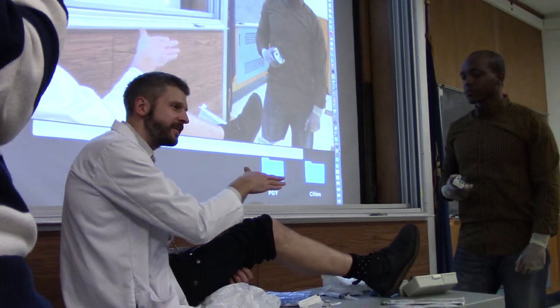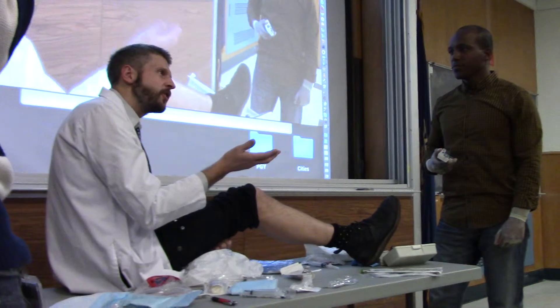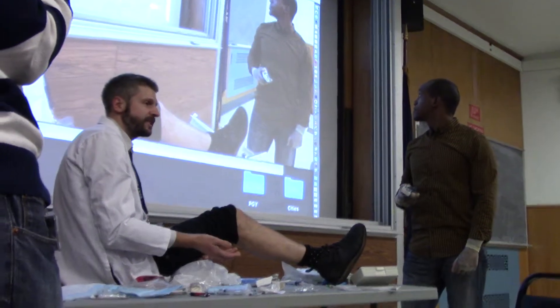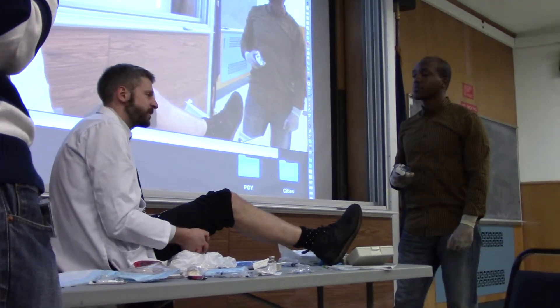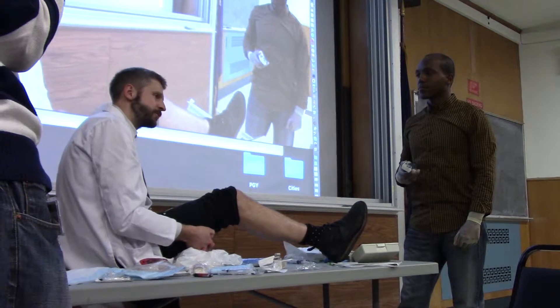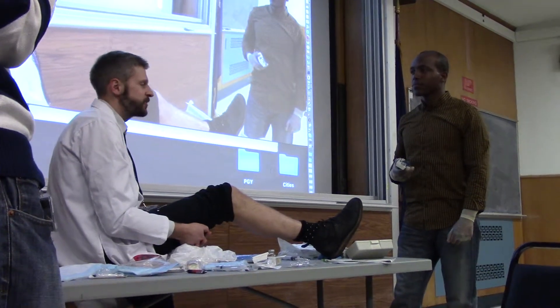Let's say you got a measurement of 29, and you're like, well, he's not quite there, he doesn't have any pain — we're going to watch it. And it's kind of like a serial FAST or something else: you can recheck that pressure later, and certainly if something's changing clinically, it makes sense to recheck.